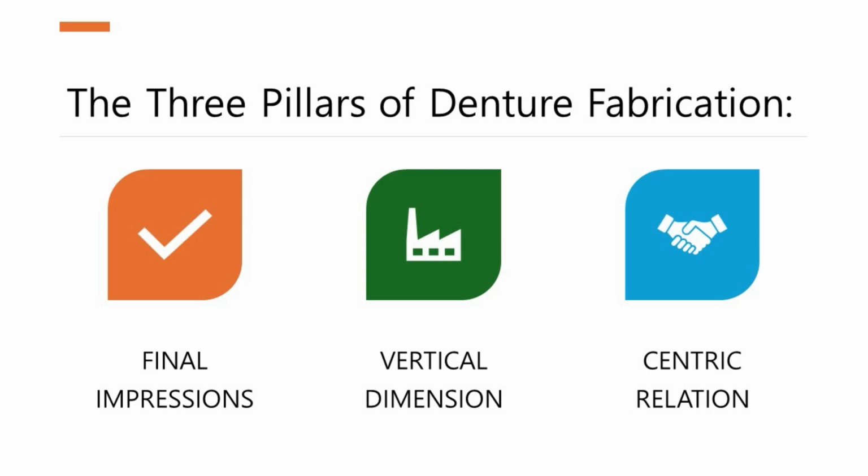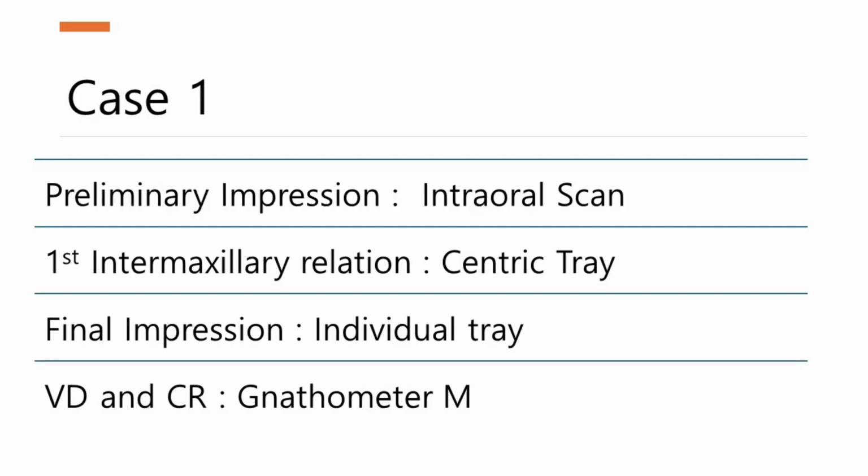of denture fabrication. In our first case study, we explore a hybrid approach that combines both traditional and digital methods to achieve optimal results in denture fabrication. Let's break down each step used in this process.